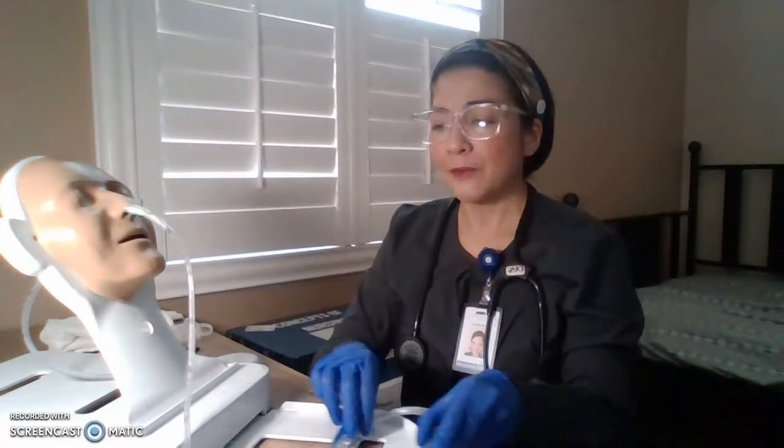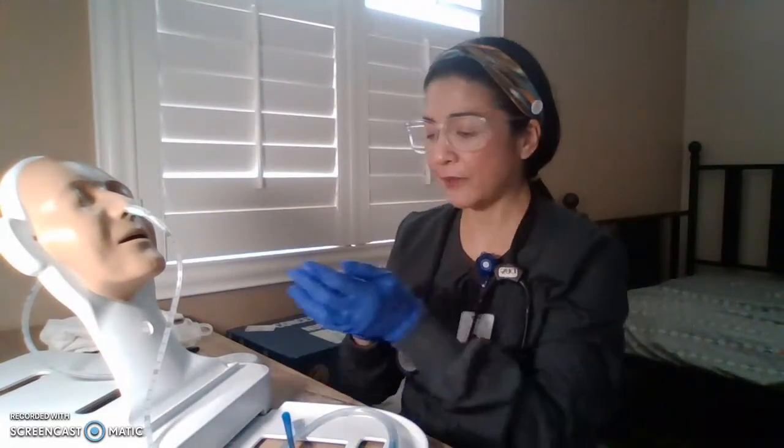All right, so once everything is done, you've left the patient, you've done hand hygiene. We are now going to document everything that we've done. So how do we document? What do we document? We document vital signs, the indication of this procedure, the size of the tube, the depth of the insertion that you've made, and confirmation of the gastric contents.